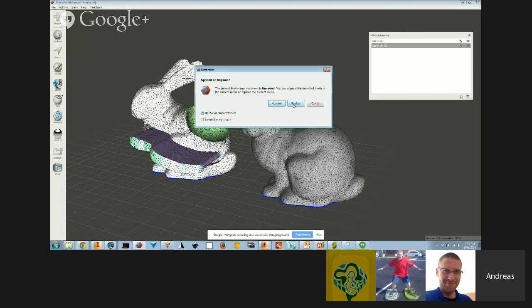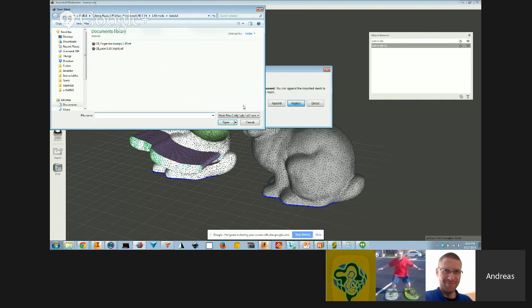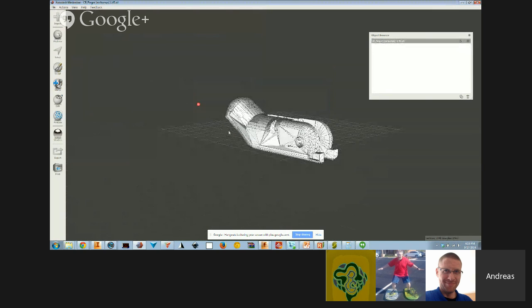So I'm going to replace the scene. In this case, I'm just going to annihilate these bunnies, and they're going to go away. I'm going to choose the finger, no bumps, open. Here we go.